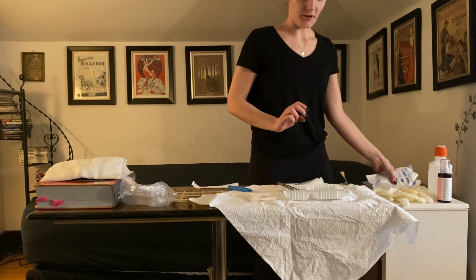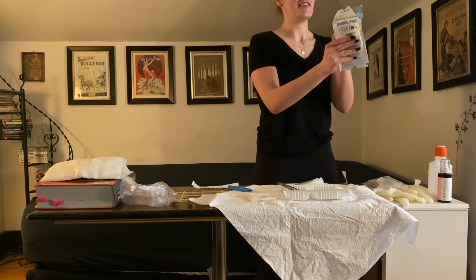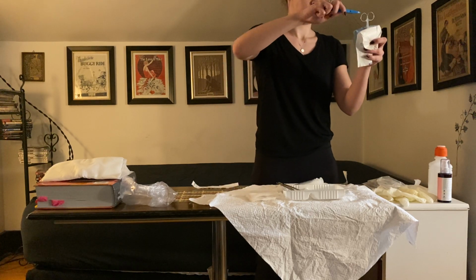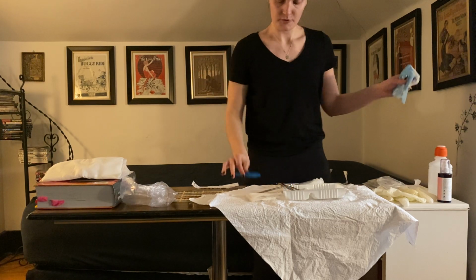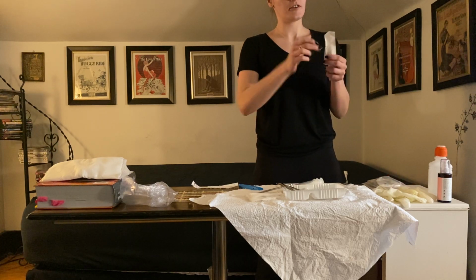And then I'm going to add my scissors here. So normally these would be unopened as well too. So I'm going to add these into the field. I like to have them kind of propped up. Adding my cotton tip applicators.